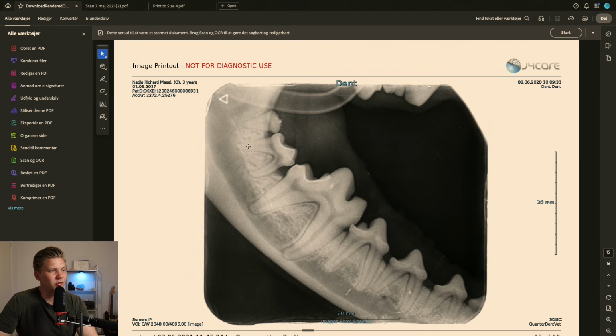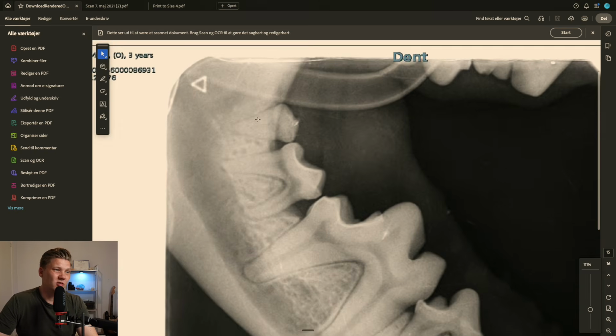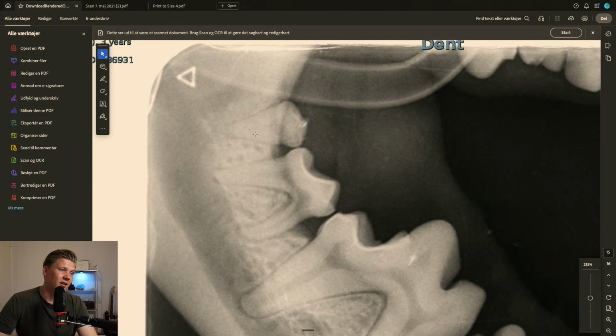And then you come to this area, and this was the tooth we saw before on the clinical photos. And now you can see that this periodontal ligament space is very wide. So you have a triangle right here, going here, where there's no bone, and there's going to be a deep pocket, and this tooth is going to be mobile for sure. This one's maybe a little bit of bone loss here, but this one is an extraction, absolutely.